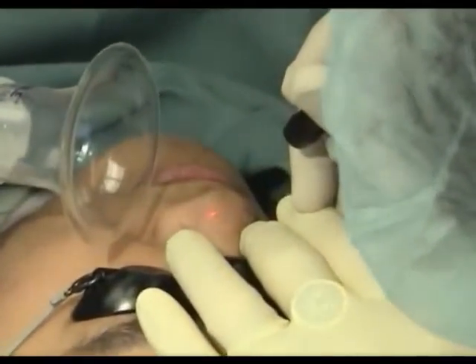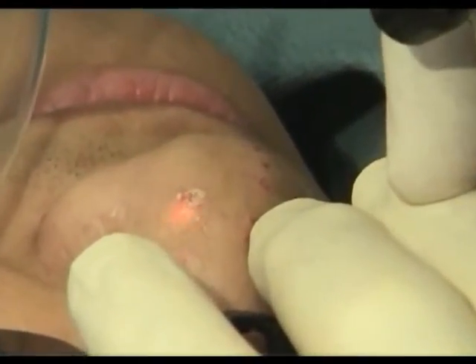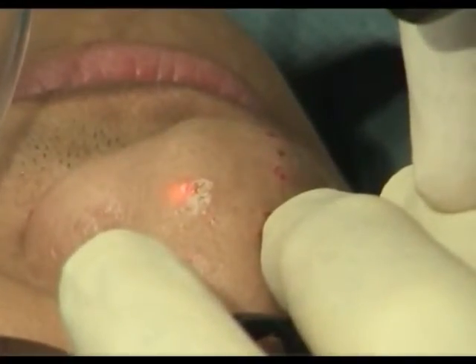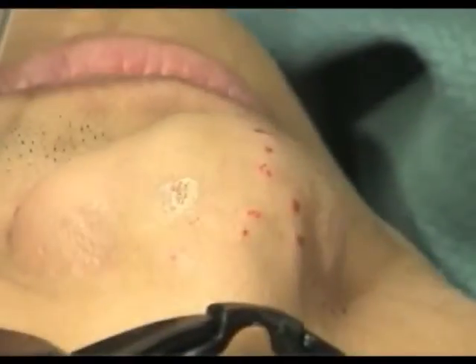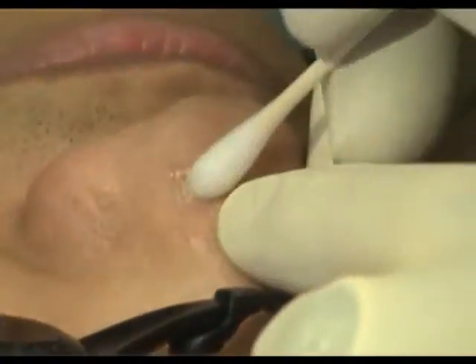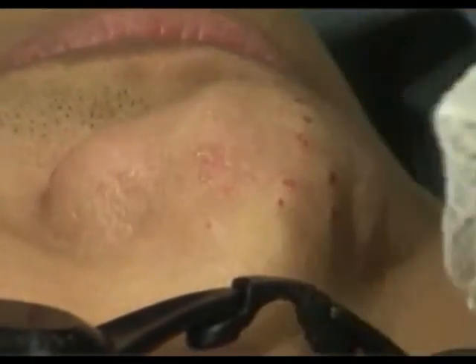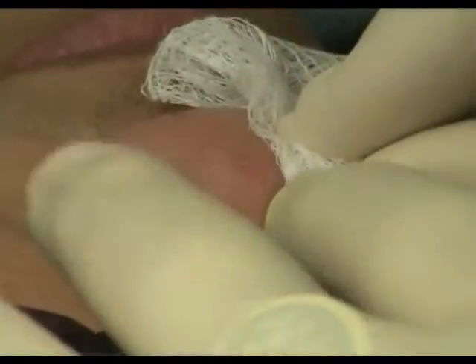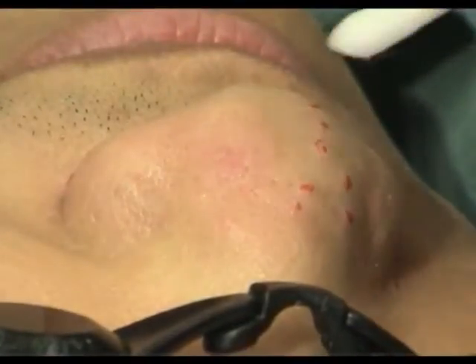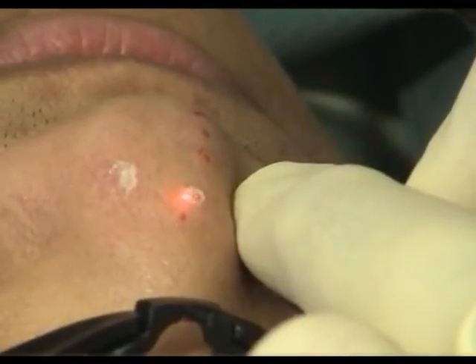Raised scars may also be improved with resurfacing lasers. Here, the ultrapulsed laser is being used with 400 millijoules at 3 pulses per second and 1.25 watts with a small spot size to flatten down the elevated scars. Pulses are made directly over the elevated area and then slightly to the edge to feather them out. It is often helpful to treat these to a level slightly below what will be flush with the rest of the skin. This will account for the reepithelialization.